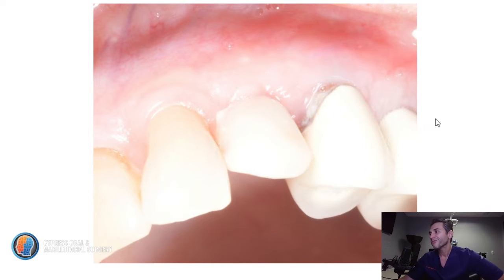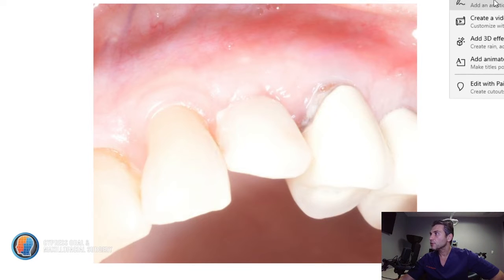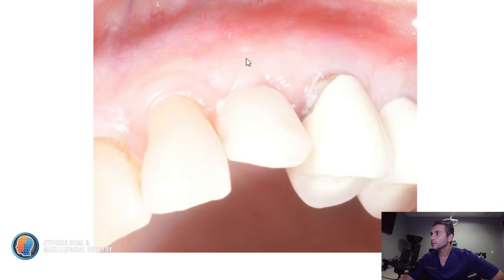This is a 65-year-old female that really wanted an immediate tooth when we put the implant. So I did a temporary. It's not the best, but it served its purpose. And one thing I want to show you, the implant platform is usually about 3 millimeters below the gingival junction, and I made a restoration that's very smooth with a nice transition.